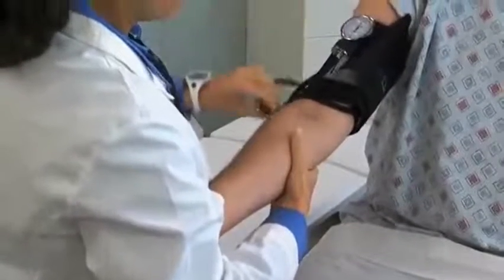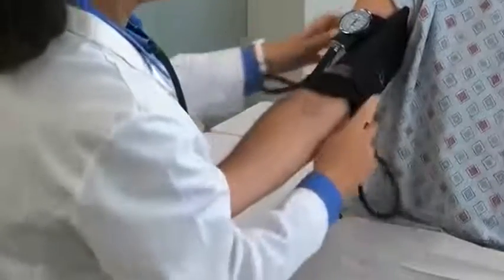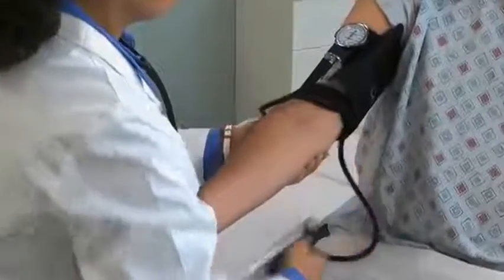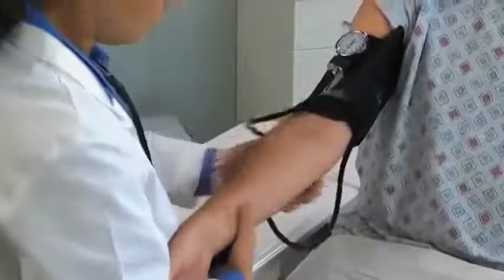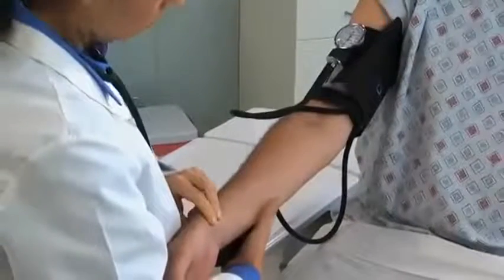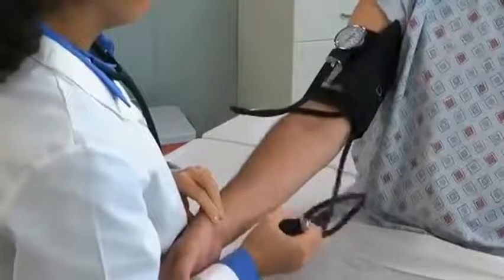When using an aneroid instrument, hold the dial so that it faces you directly. To determine how high to raise the cuff pressure, first estimate the systolic pressure by palpation. As you feel the radial artery with the fingers of one hand, rapidly inflate the cuff until the radial pulse disappears.